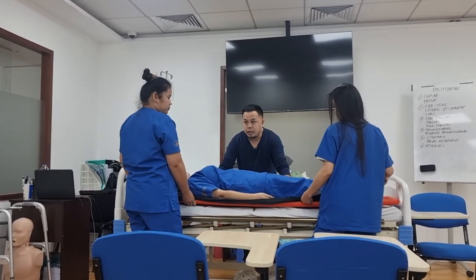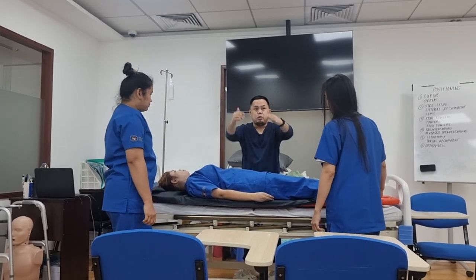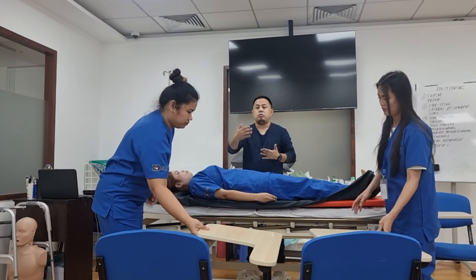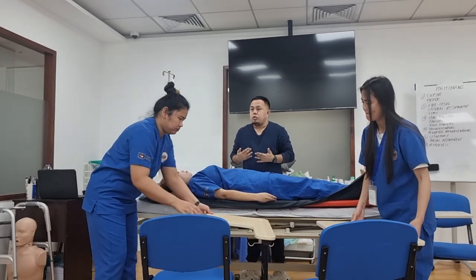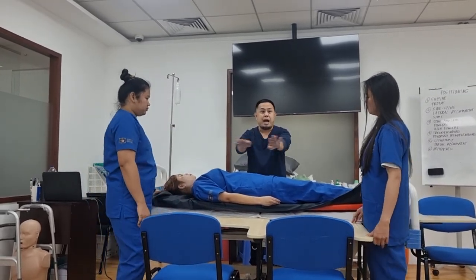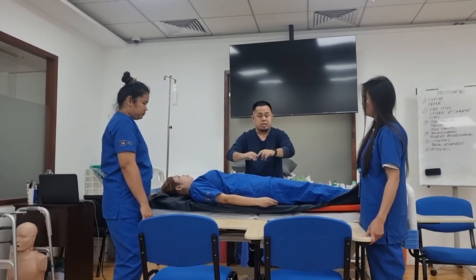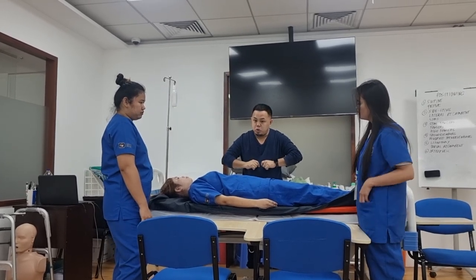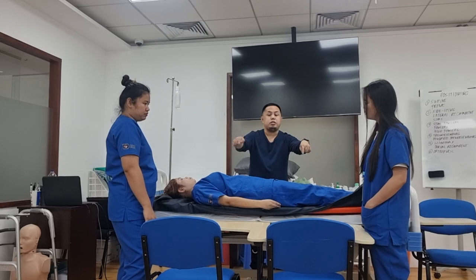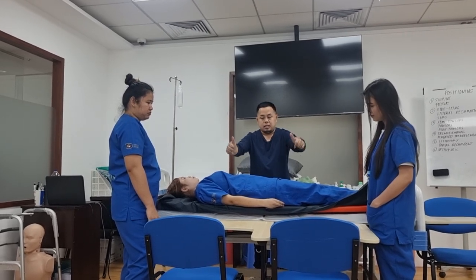Now ask your colleague: 'Can you move the stretcher bed towards the patient's bed?' The stretcher bed should be at the same height or the same level as the patient's bed so that it is easy to slide and transfer. Make sure the wheels are locked.